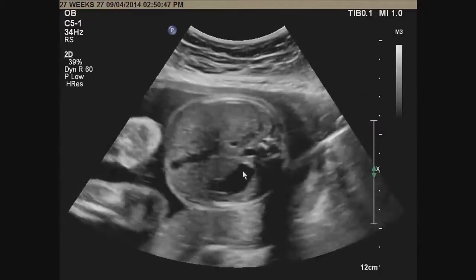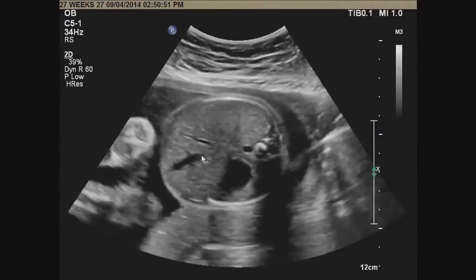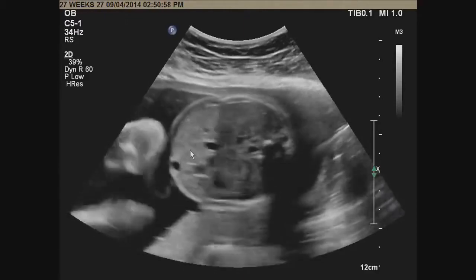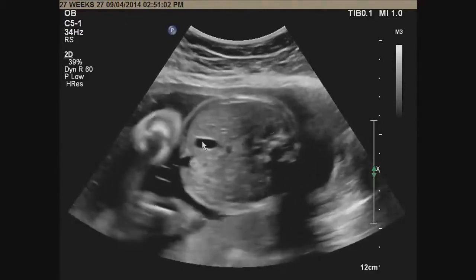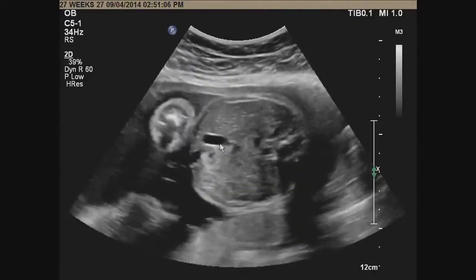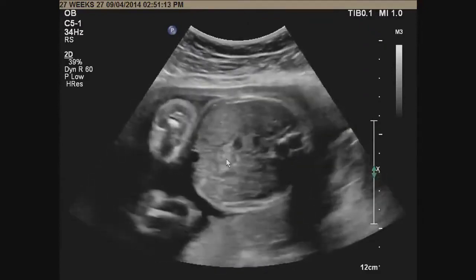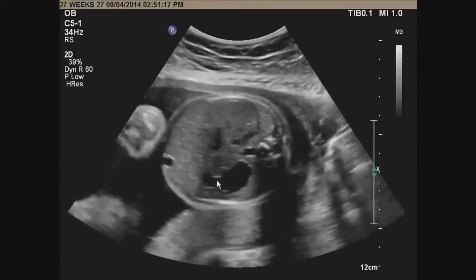That tells you that you are in an almost perfect transverse view. So as I look at the abdominal situs, I see the umbilical vein coming in. I see the venous system in the liver, but I also always look to see the gallbladder in the fetus. And I want to see the gallbladder on the right side of the abdomen. Important when you're dealing with heterotaxy, to make sure you're not dealing with problems related to the biliary system in the fetus, because that certainly changes the prognosis substantially. So I have a normal situs in the fetus.